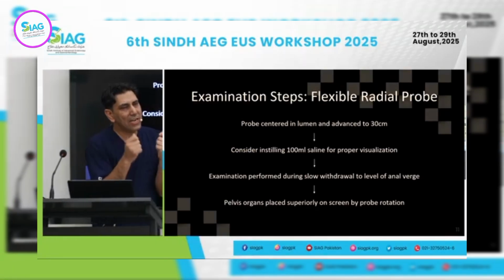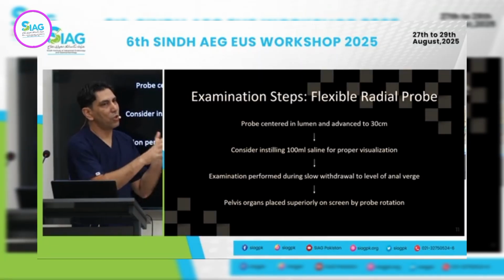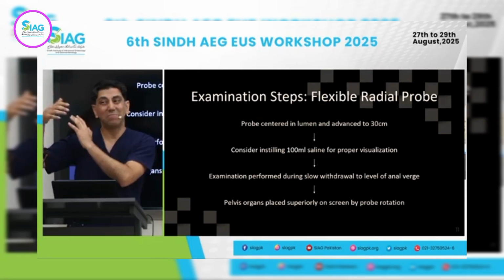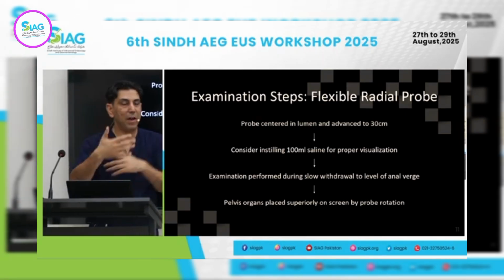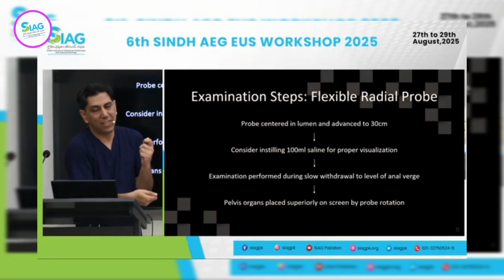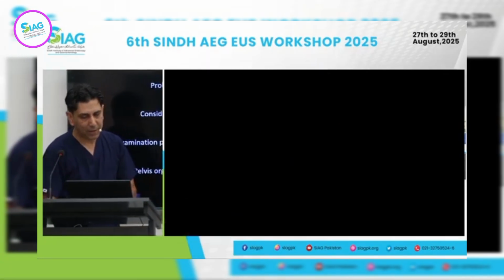Here, because it's slightly different and not something that we do quite commonly, you need to just orientate yourself. So you may want to have an image on the monitor which is accessible, or an iPad if you have access to it, and then you orientate yourself to the patient position, especially if the patient is lying on the left lateral side.